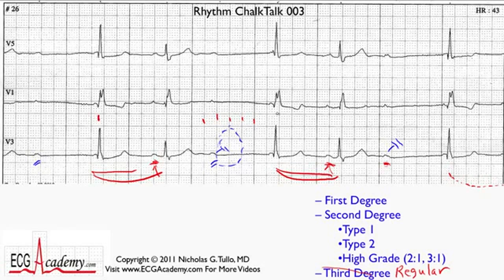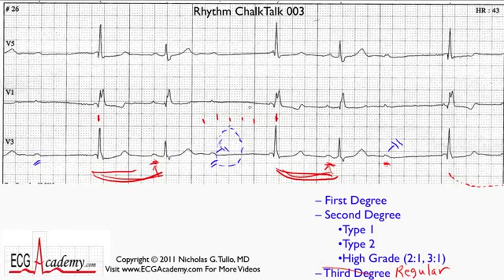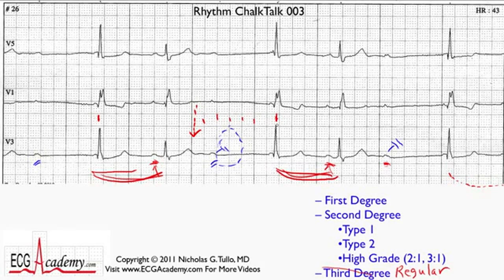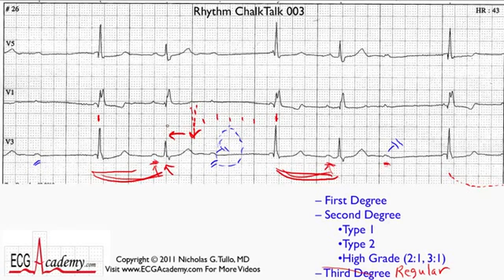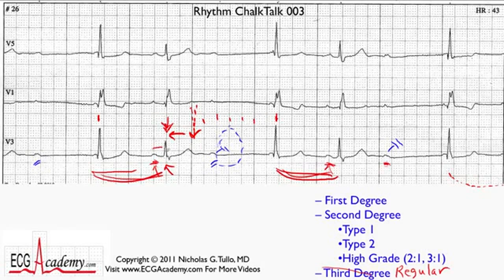If you look at two of these beats at the beginnings of these groups, and let's just say this was an escape rhythm — if we find the midpoint between these two beats, and if none of the P waves were getting through, a QRS would have fallen somewhere around there. But instead, this QRS was moved up — it occurred earlier. That tells you this QRS had to have been conducted from above. It makes sense because there is indeed a P wave in front of it, and interestingly the PR interval here is about 0.2, which is around the same as the PR intervals we saw in Chalk Talk number two.